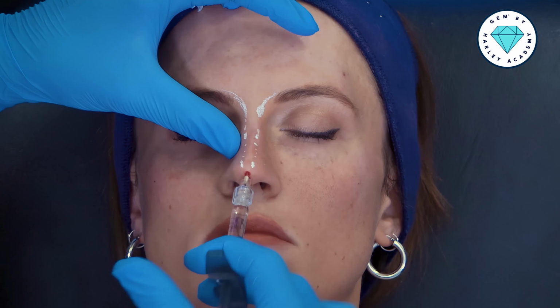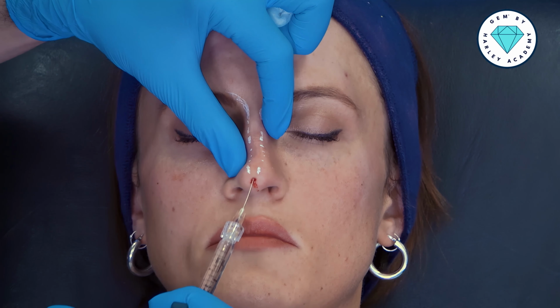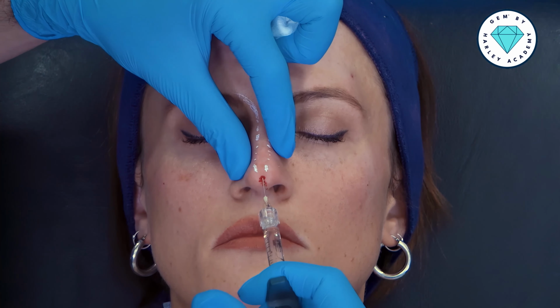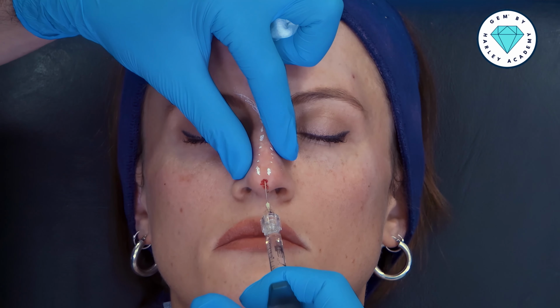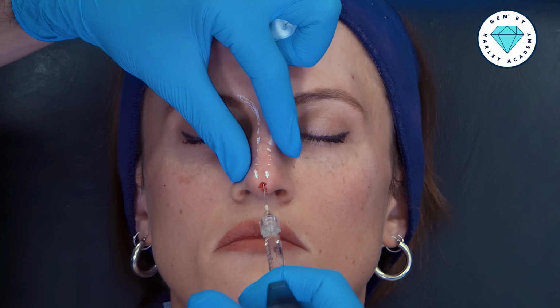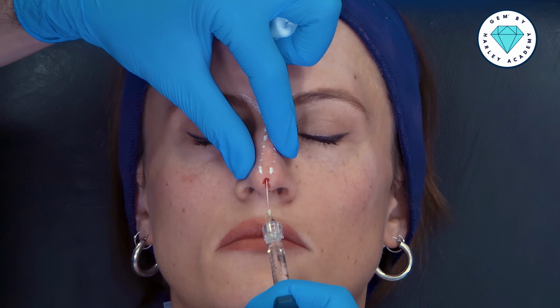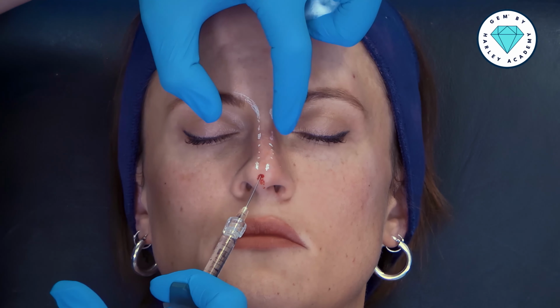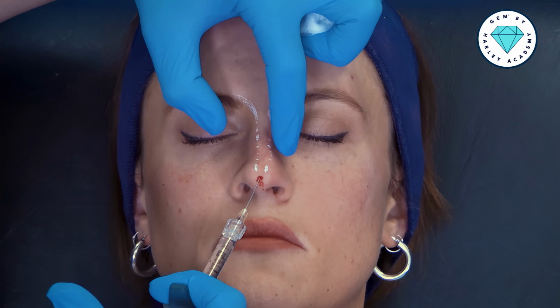So treating this patient's left aesthetic line, and then moving and treating the patient's right aesthetic line. And then some extra focus here where the notch is on the patient's left.